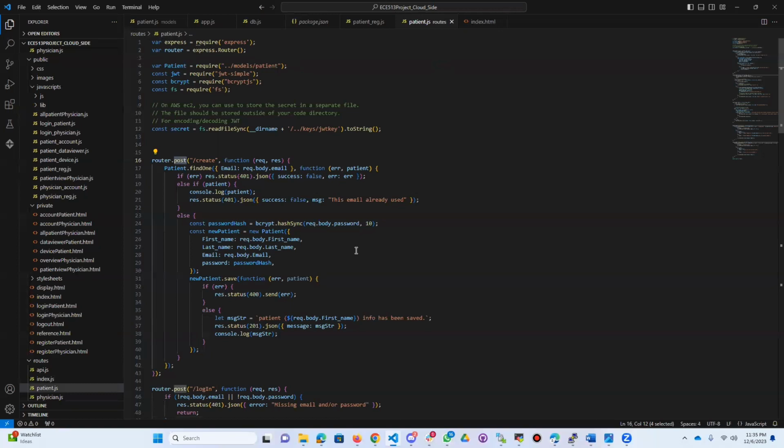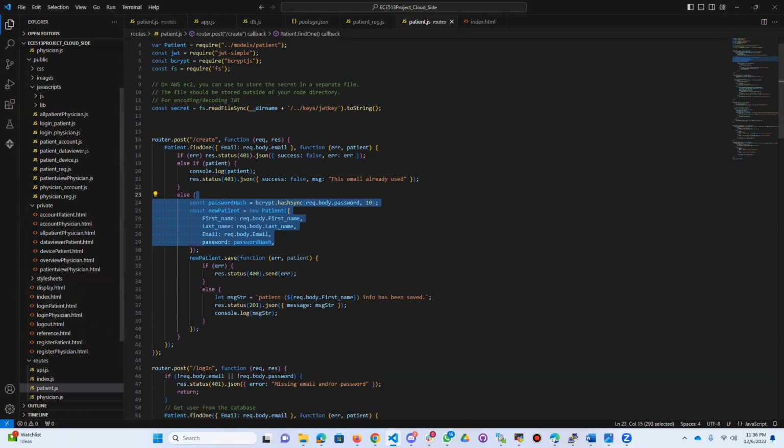Here is the handler of the Express.js POST request to the create endpoint for patient registration. Let me explain what it does. First it checks if a patient with the provided email already exists in the database. If so, it returns a response indicating that the email is already in use. If the email is unique, it securely hashes the provided password, which makes it a very strong password. Here you can see. And then upon successful registration, it responds with a 201 status and a message confirming that the patient information has been saved, which I already showed you. And moving to the next part, the patient account.